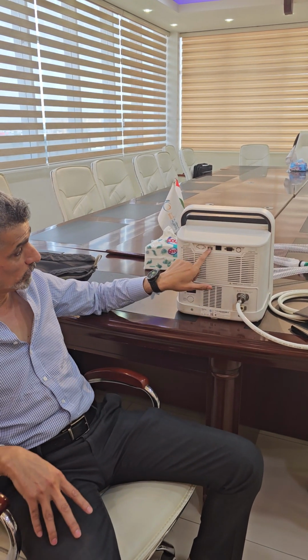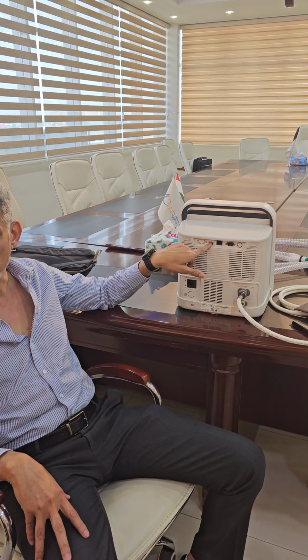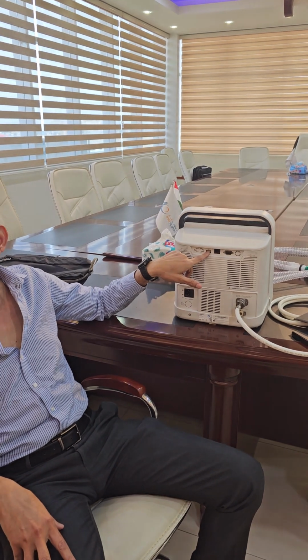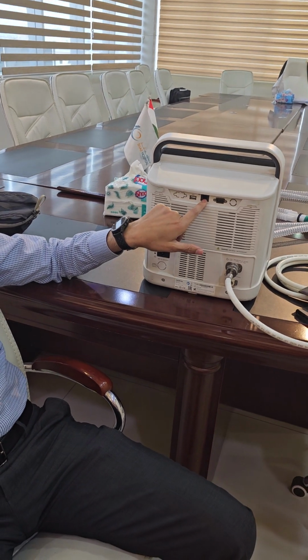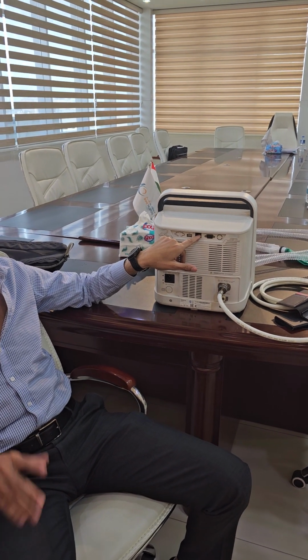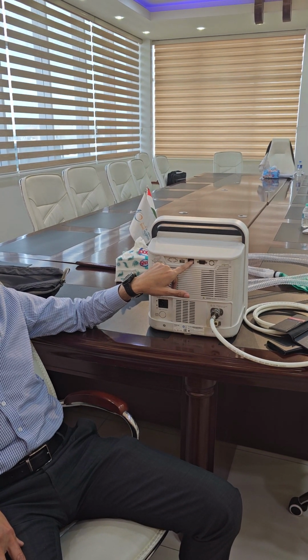And this port is the universal serial bus, which is the USB. It's used for connection over a short distance, like connecting with a computer, with another LAN, with a monitor, and so on. This, what is it called? Anybody knows? This is LAN, local area network. It's very good for long distance transfer, and it can also be connected with the phone, with the mobile, with the landline. Clear?